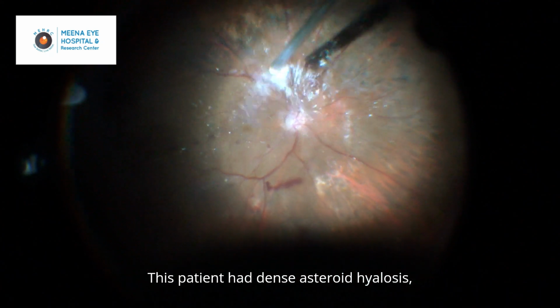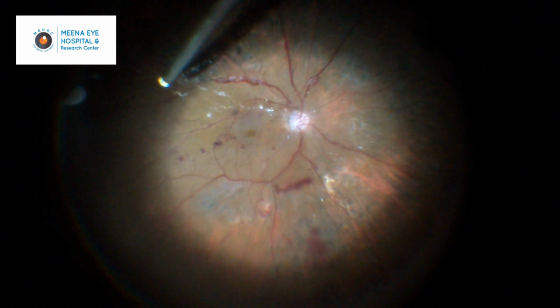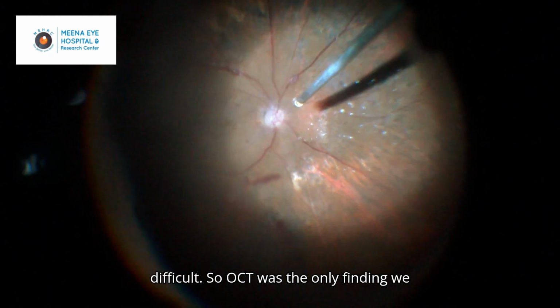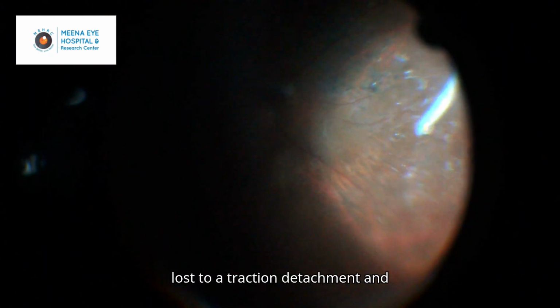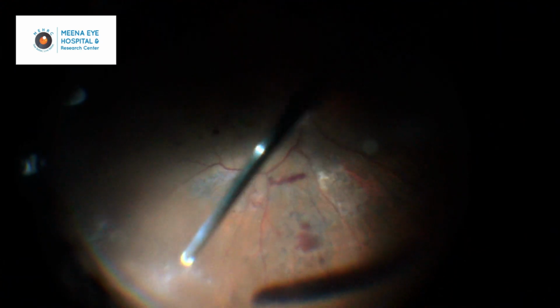This patient had dense asteroid hyalosis, making the view of the retina pre-op a little difficult. So OCT was the only finding we had. The other eye of the patient was lost to tractional detachment, and this was a one-eyed patient.